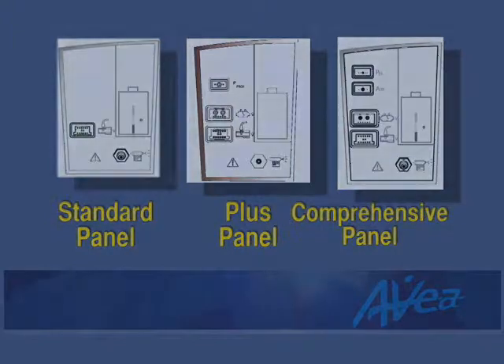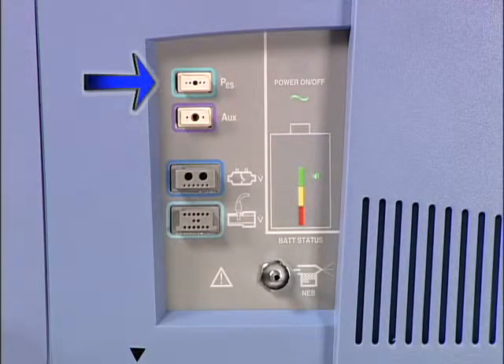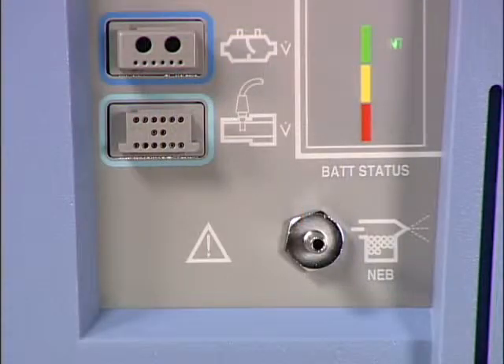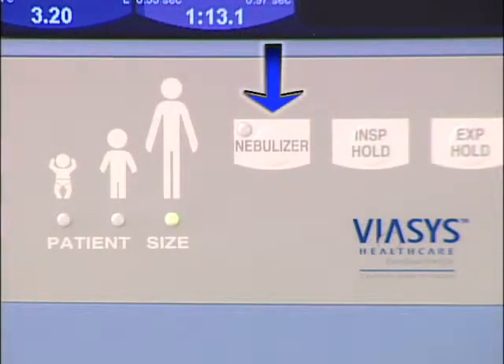For the comprehensive model, connections are present for proximal flow sensors, esophageal balloons, and tracheal catheters. These applications will be covered in a separate program in the AVEA training series. An integrated nebulizer port is located below the sensor connectors. Connect any disposable or reusable medication nebulizer to the port and activate with the nebulizer button on the user interface module.